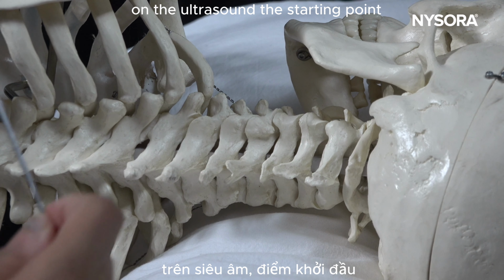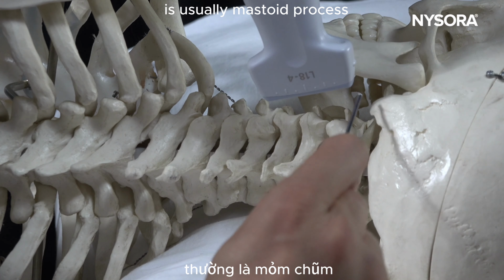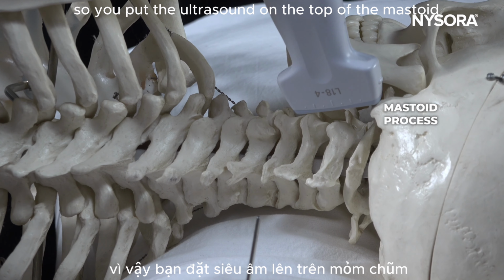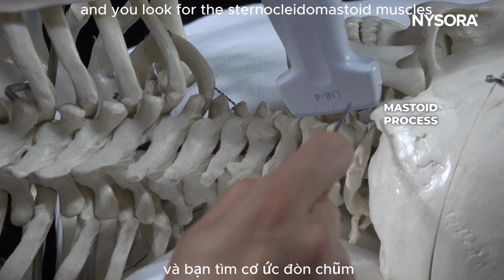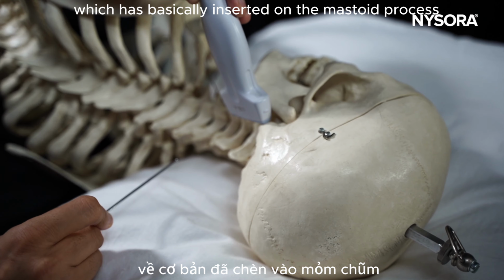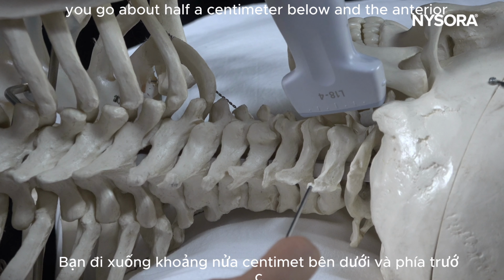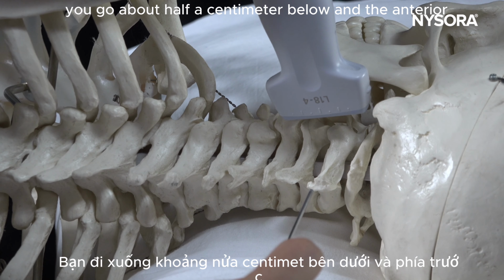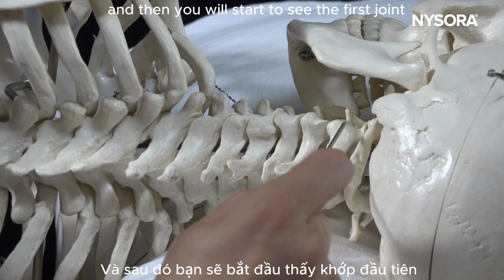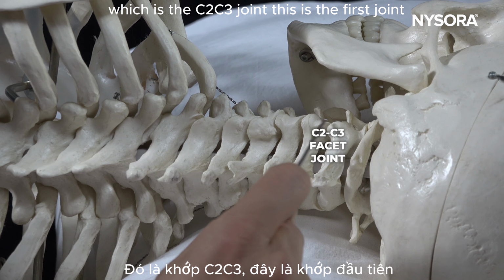The starting point when you use ultrasound guidance for the cervical medial branches is usually the mastoid process. So you put the ultrasound on the top of the mastoid process and you look for the sternocleidomastoid muscle, which basically inserts on the mastoid process. Once you have done that, you go about half a centimeter below and anterior, and then you will start to see the first joint, which is the C2, C3 joint.